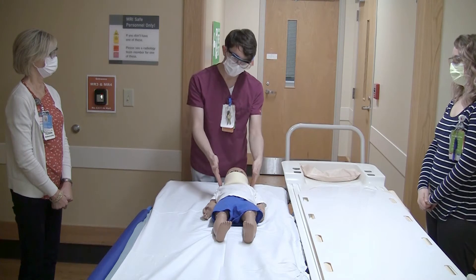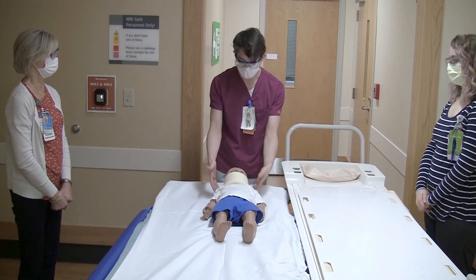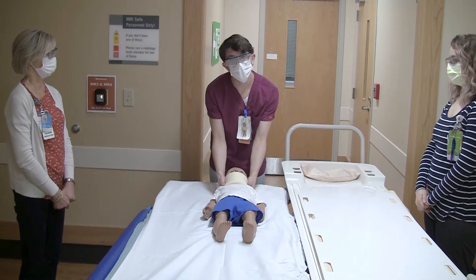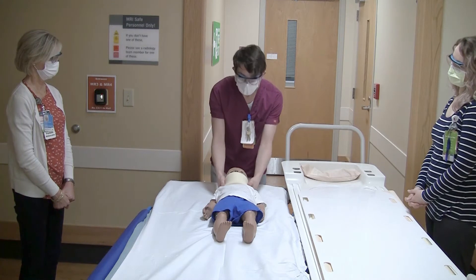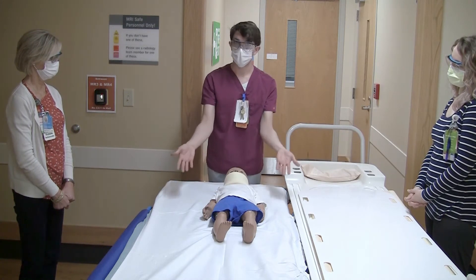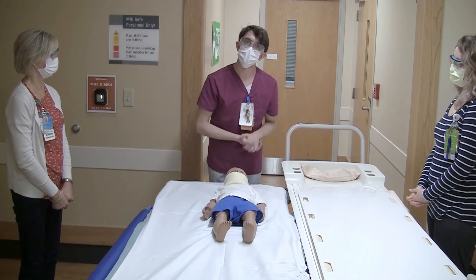I wanted to point out that since this patient has a C-collar, I have positioned myself at their head so that I can support the neck and head through the entire move, preventing it from twisting or jarring during the transfer. Since this patient is of a smaller size, three people should be plenty to get him from one bed to the other.